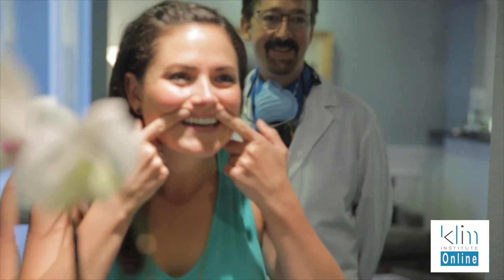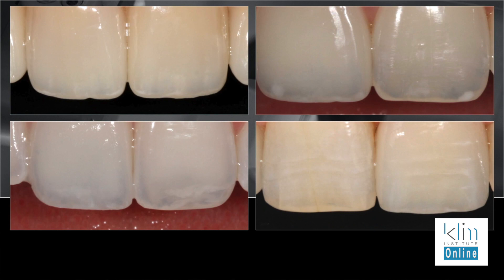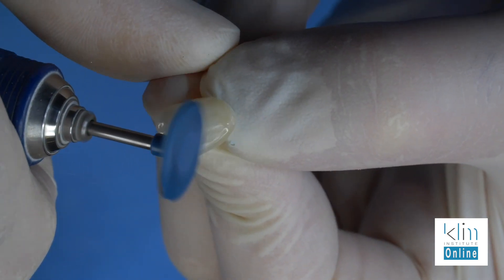Every mouth has a different aesthetic chemistry set. We have the patient's emotions, their lips, their soft tissue, opalescence, fluorescence — there's a lot of things we're looking at: shape, value, all those things need to work. But the most important thing is once you have your value with your shape, you've got to get the value of your ceramic right — value is very important. Once you have that shape, the final piece that really solidifies what we're trying to do is superficial gloss finish, and that's what this video is all about. I'll show you my current journey on it and the polishers I use.